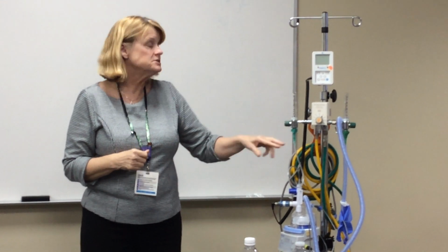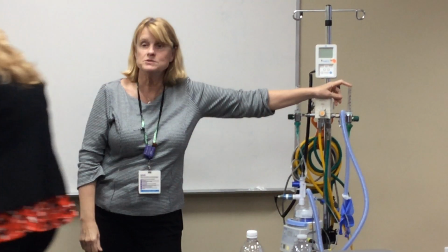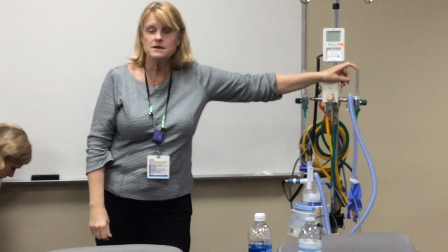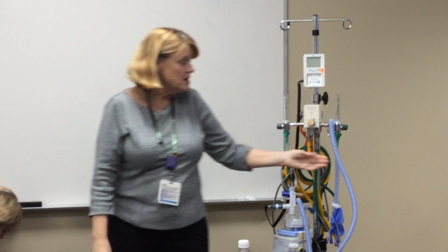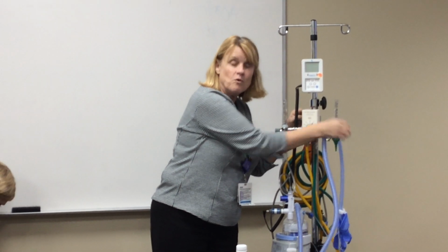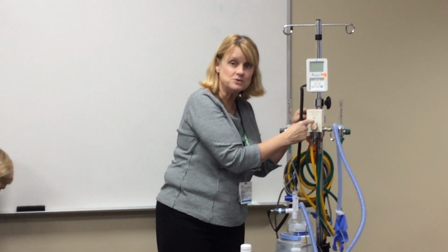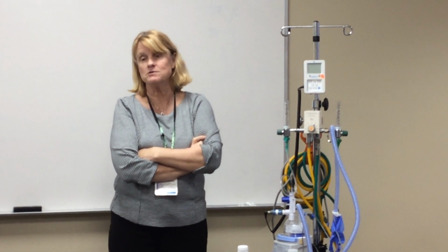Do you want one of those cannulas, baby? Yeah, you can show them what it looks like. Now, the other thing that some use this for is, if you have a really, really sick kid, now you have the benefits of the blender. They actually put the flow inflating bag on here so that you don't have to use 100%, but you can get the precise FiO2 if the baby had to be suddenly manually resuscitated.